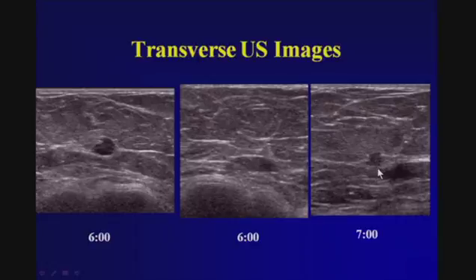So in this particular case, I'm going to biopsy the 6 o'clock lesion with core biopsy, and then I'll biopsy the lesion furthest away, which in this case is the 7 o'clock. And here I did FNA as I have good cytology support. Lacking good cytology support, you would go for core biopsy in this particular case. So both of these were biopsied.